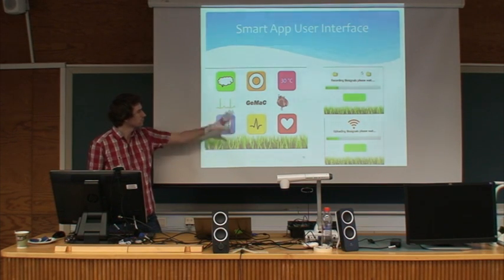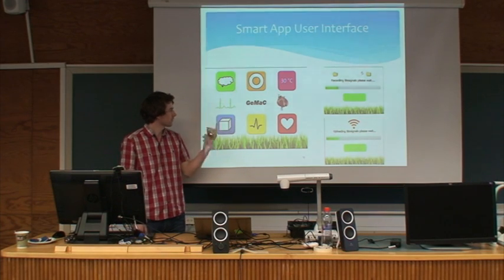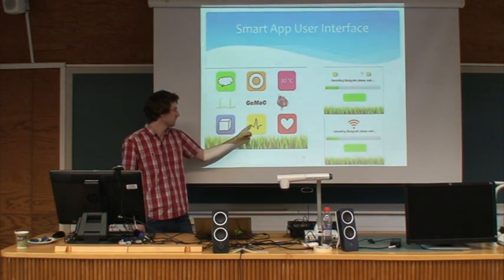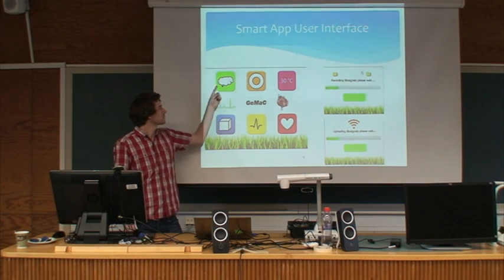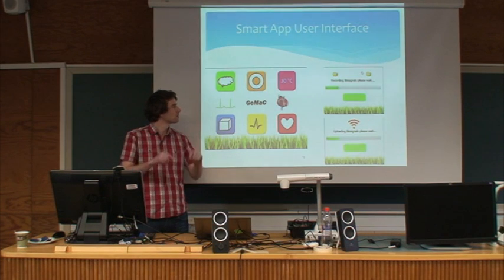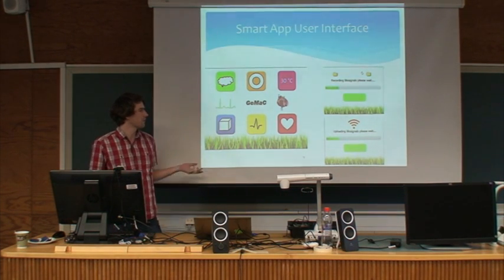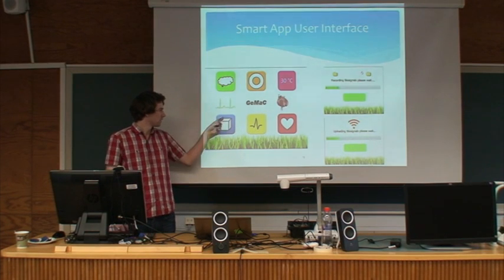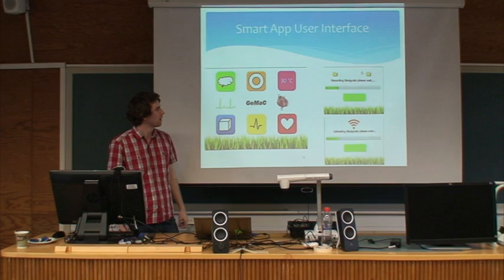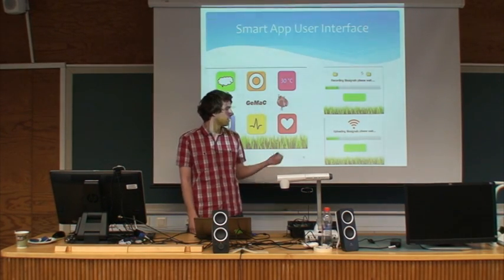We have a main screen where you boot up your device. You can select which measurement you want to make: airflow, pressure, temperature, pulse, ECG, glucose. We used simple icons, so even older people who can't read small fonts can use them because they're easy to remember. Like a heart is pulse, a square is sugar, so it's easy to remember. And these are just some screens when you're recording your data and when you're sending it to the server.